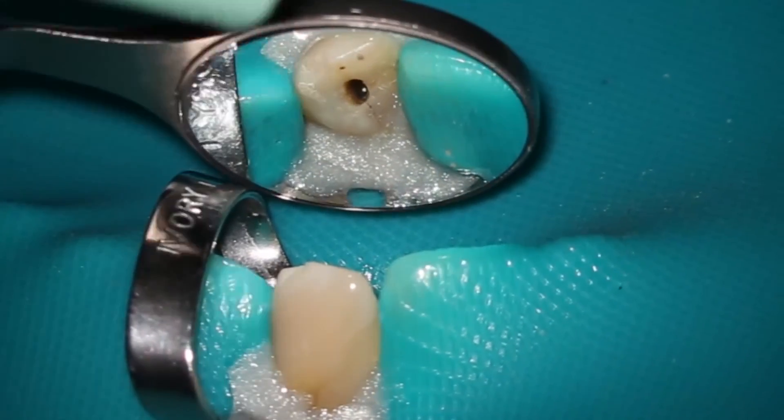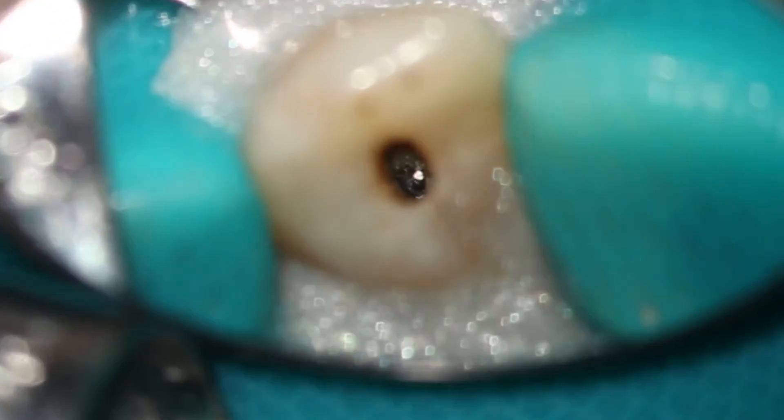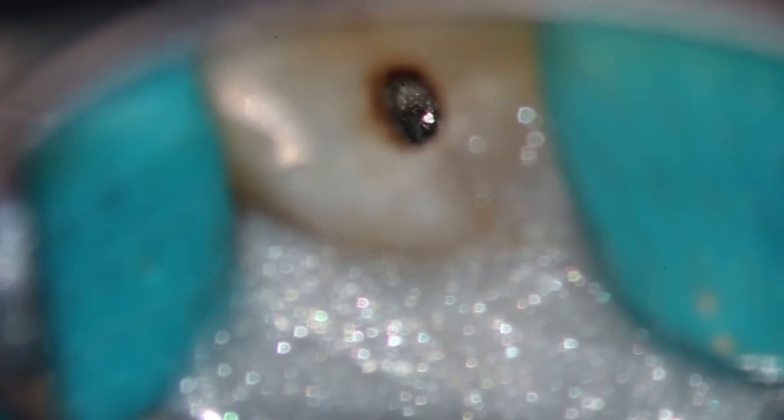Now we are creating the troughing groove around the instrument, trying not to touch the instrument at all. This can be done wet because you can actually feel the separated instrument with the SP2. Now you can see we've created a troughing groove around the separated instrument circumferentially.